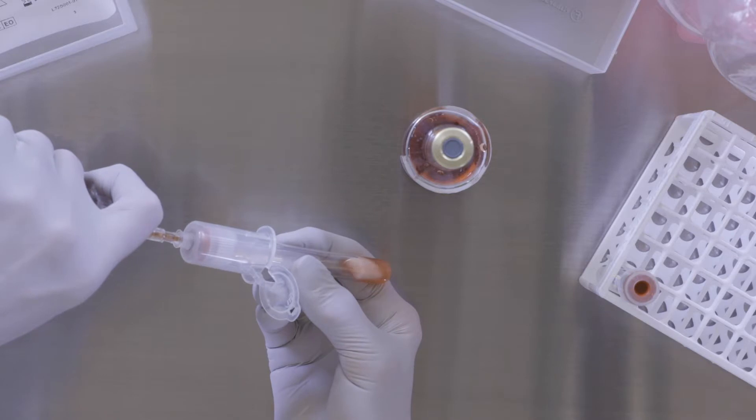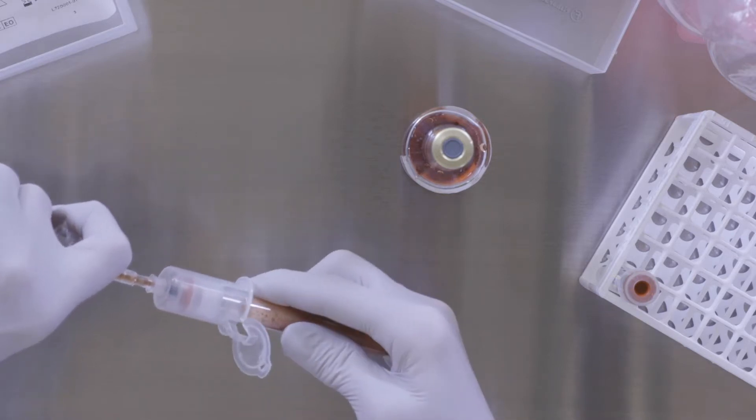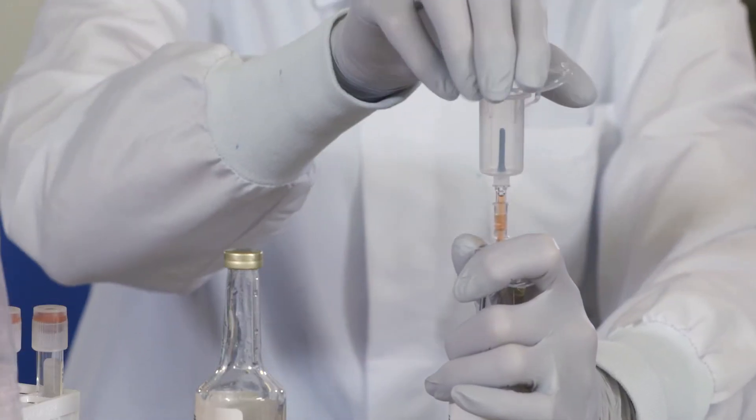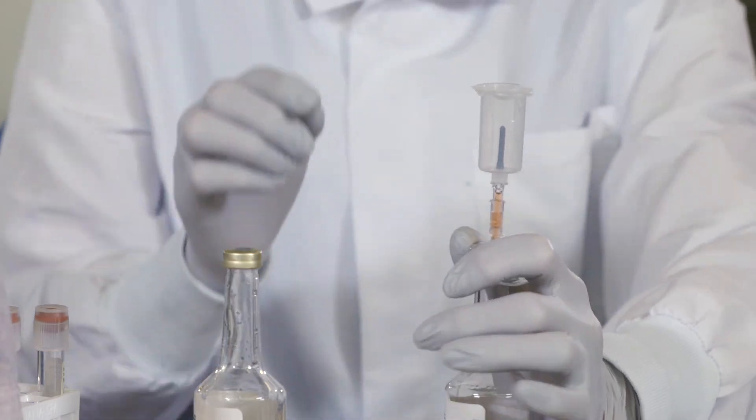When the sample transfer from the culture bottle into the vacuum tube is complete, remove the vacuum tube from the transfer capset. Now, turn the culture bottle to the upright position and close the safety lid on the tube holder.